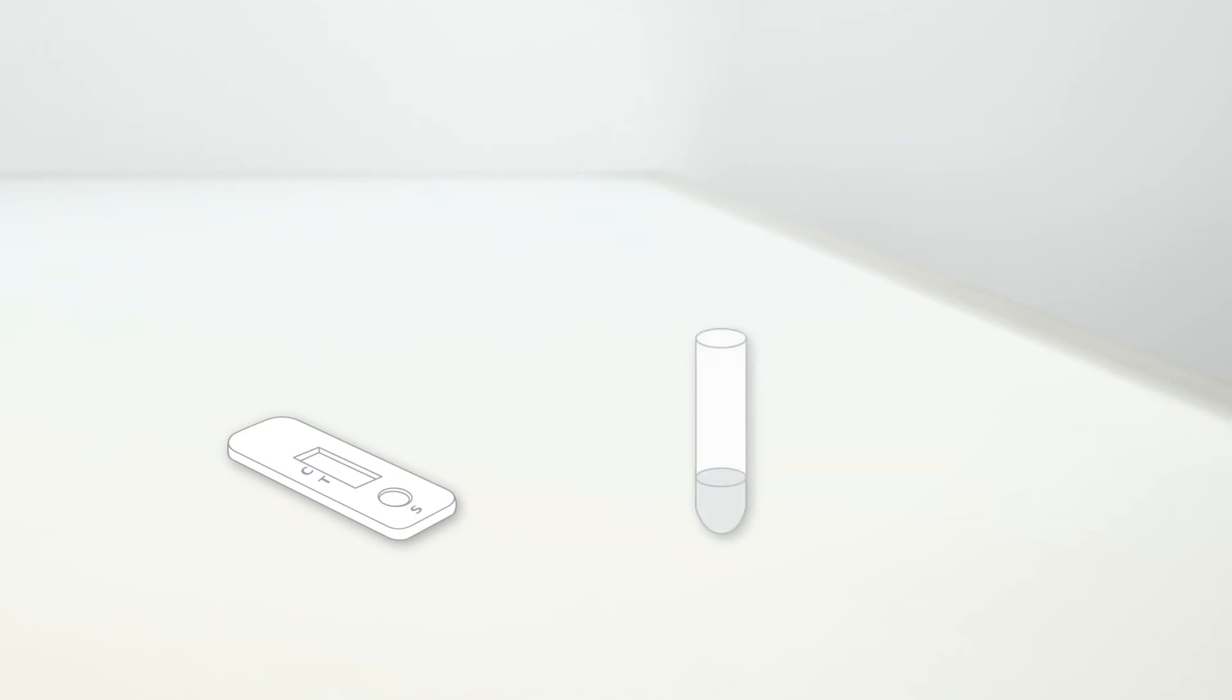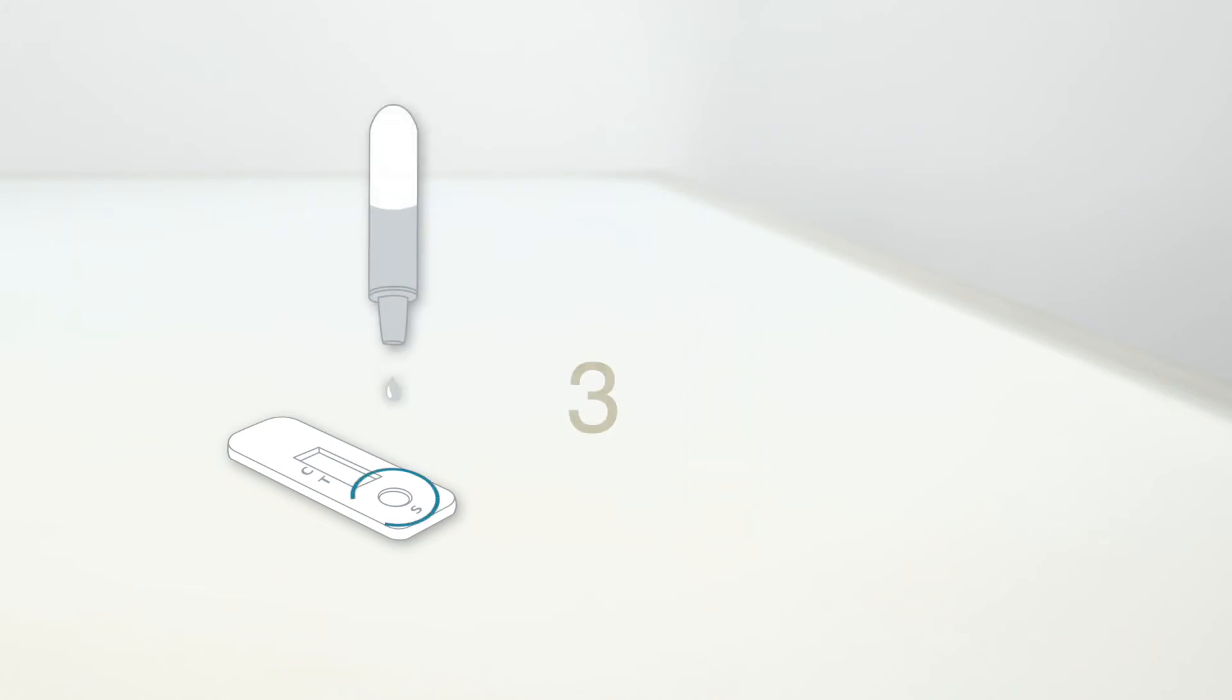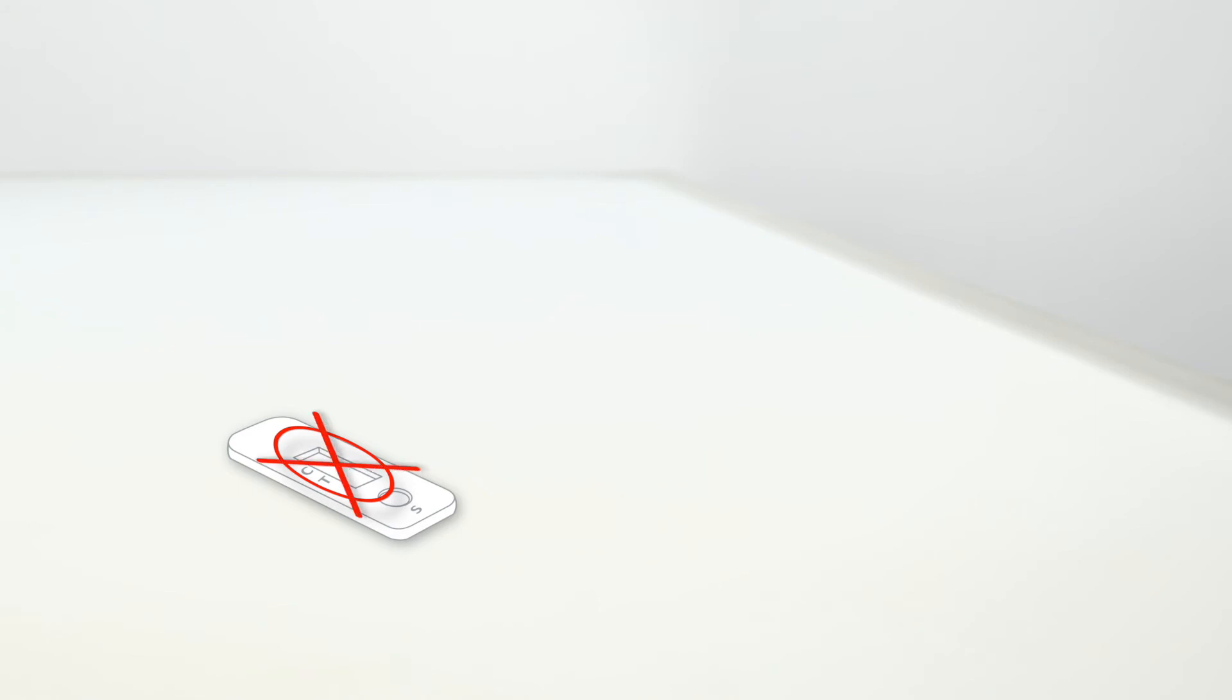Remove the test cassette from the foil pouch and place it on a clean, level surface. Attach a dropper cap to the extraction tube and make sure that it is on properly. Squeeze gently to dispense 3 drops of fluid into the round sample well S of the test cassette. Do not add the sample to the rectangular result field.